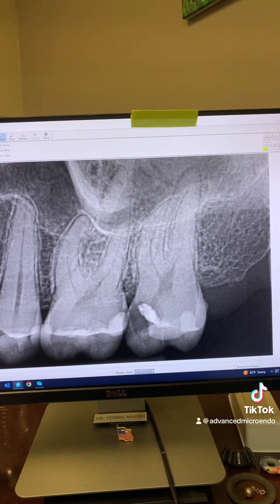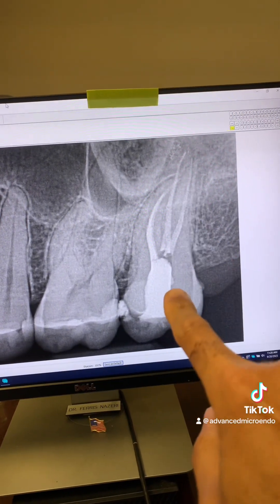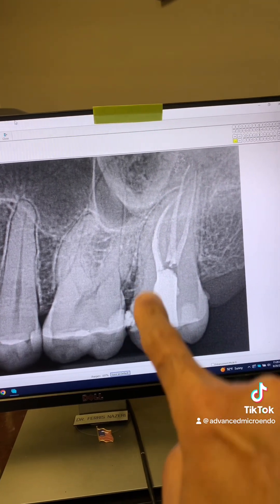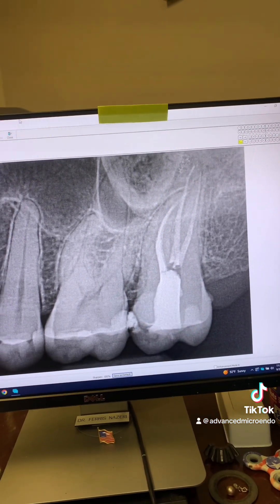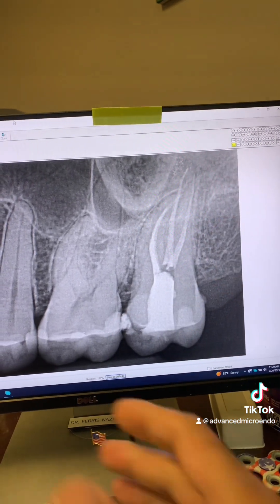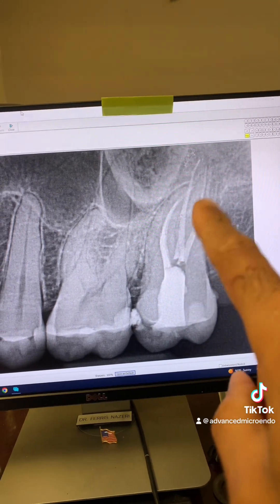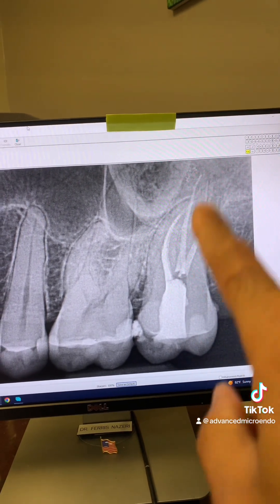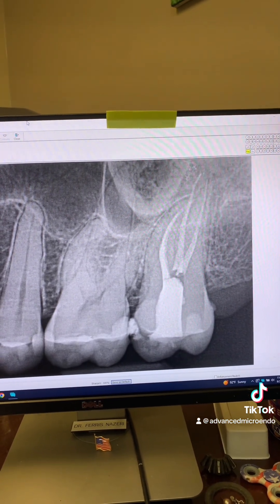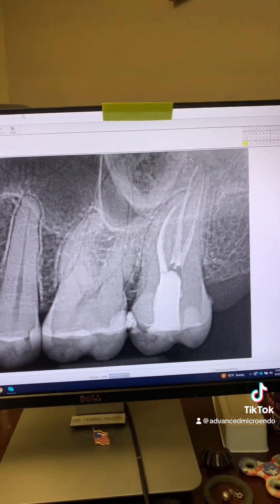So let me show you the post-op. Here's one post-op — you think three canals, 21-millimeter long roots. We went ahead, cleaned out the decay, rebuilt the mesial wall, and then the endo-access was made, all under a rubber dam. You see three canals here, 21-millimeter long roots. Let me show you a different angulation. Also pay attention to the conservative endo-access right there.